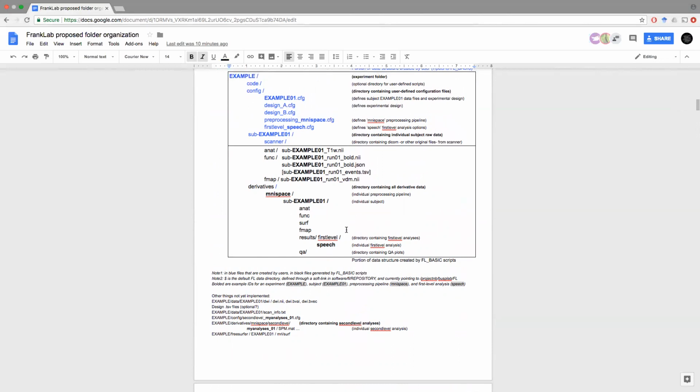So in our typical default preprocessing pipeline that we use for volume-based analysis, called preprocessing underscore MNI space, one of the main purposes is to put the data in MNI space, this reference space where you can do inter-subject correlation nicely, because any particular voxel for any particular subject is located in the same place along the anatomy of the brain, or approximately the same place where we expect to have reasonably similar functionality. So that's what MNI volumetric space is.